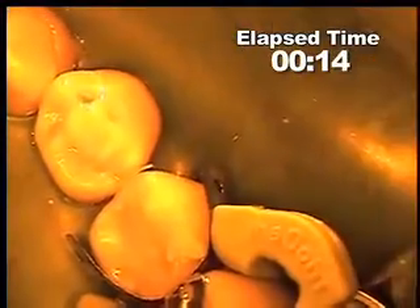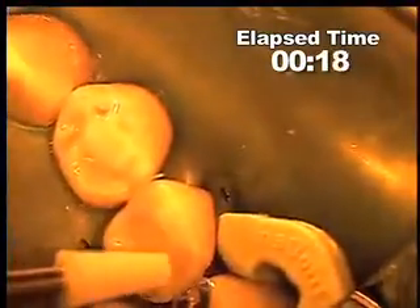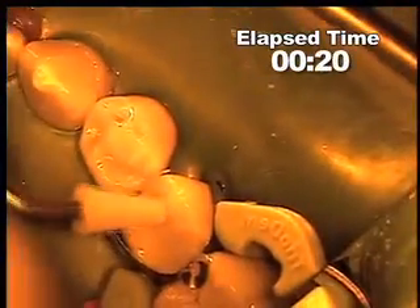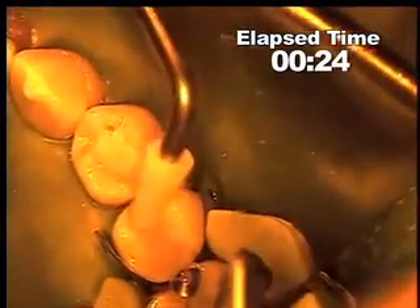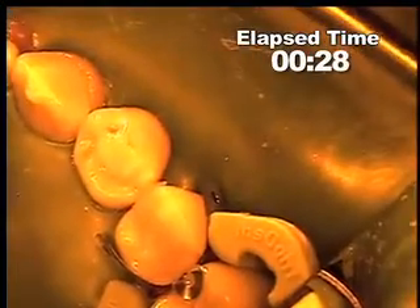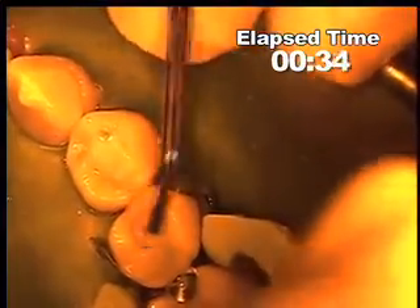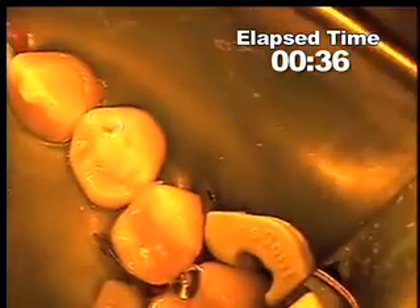The instrument being used first is the combo roller to smooth and actually kind of adapt as well as remove excess. Next I'll go to the American Eagle instrument starting with the plugger to get a little bit more adaptation.